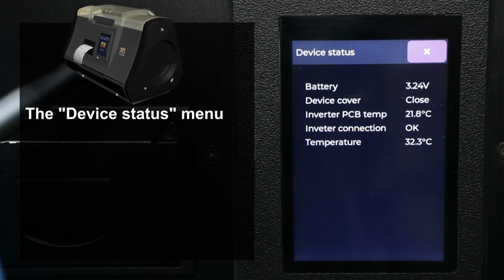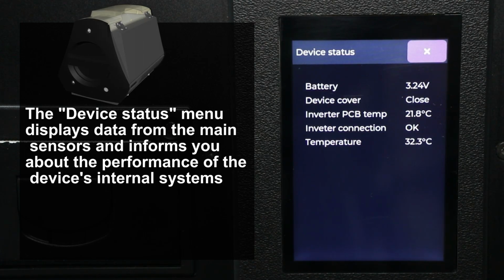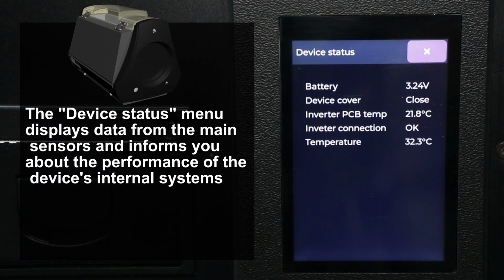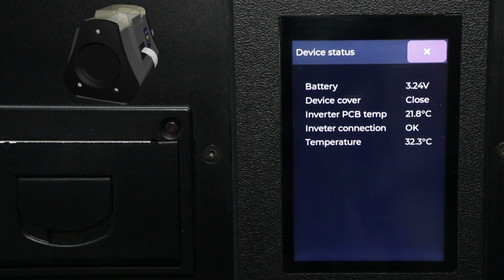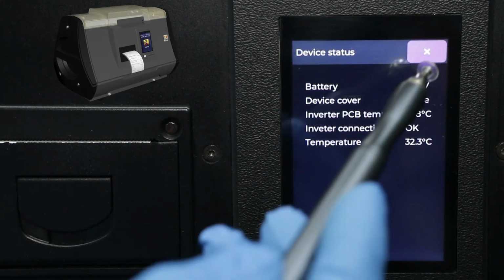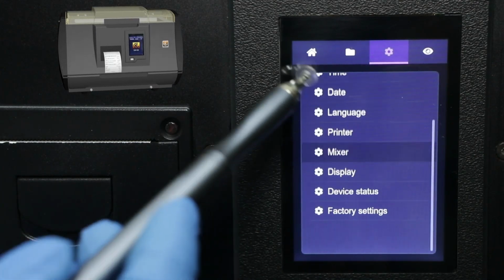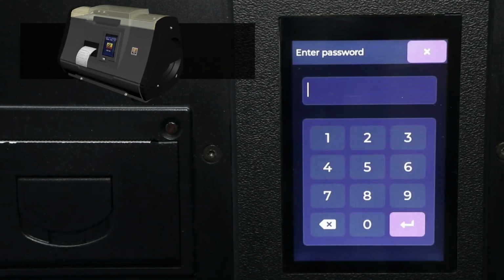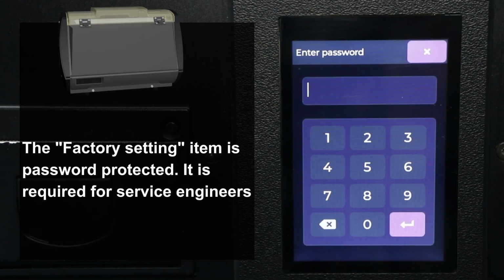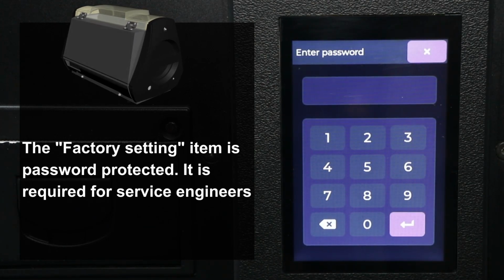The device status menu displays data from the main sensors and informs you about the performance of the device's internal systems. The factory setting item is password protected. It is required for service engineers.